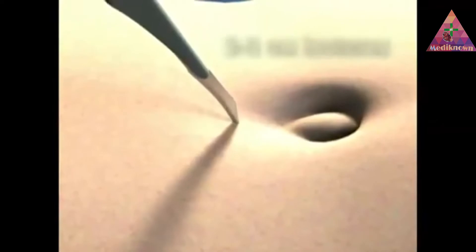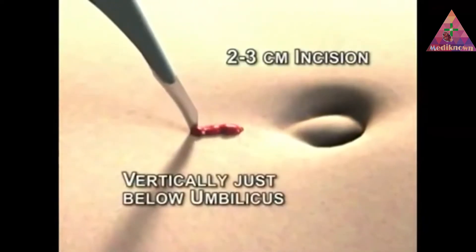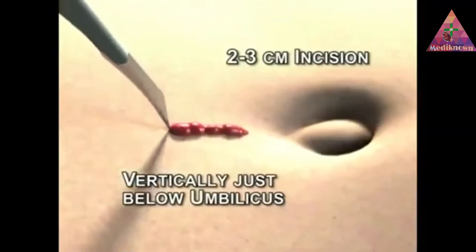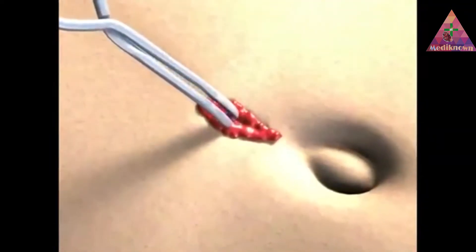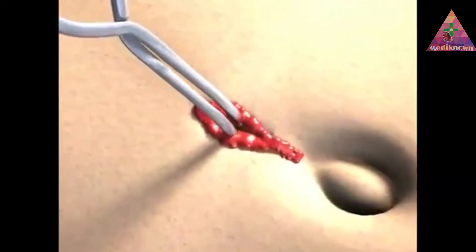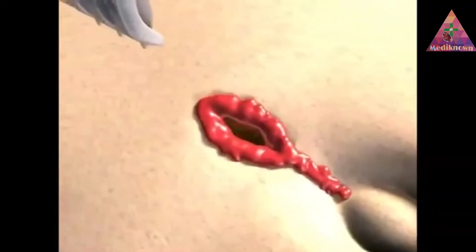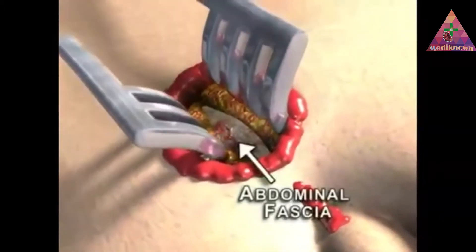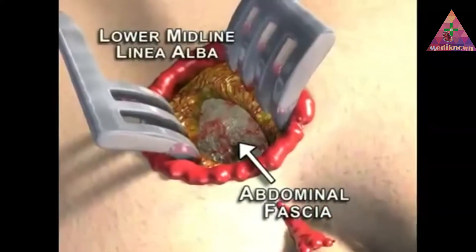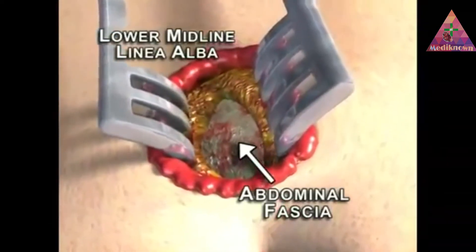A small 2 to 3 centimeter incision is made through the skin vertically, just below the umbilicus. The subcutaneous fat is spread bluntly with a hemostat or retractors until the anterior abdominal fascia is encountered. In the lower midline, this is the linea alba and represents a single fascial plane overlying the peritoneum.